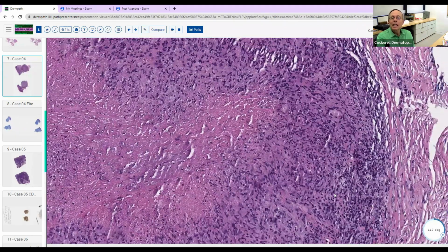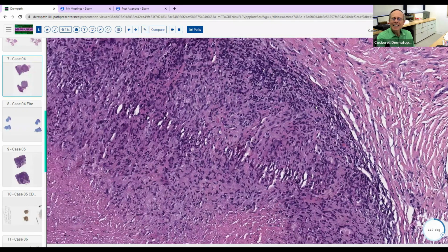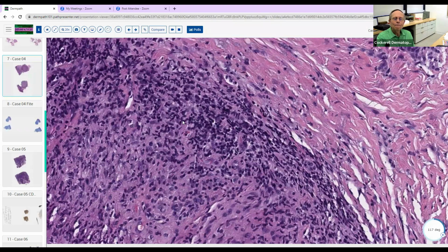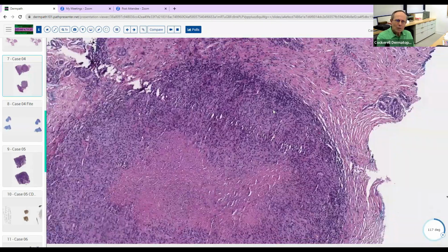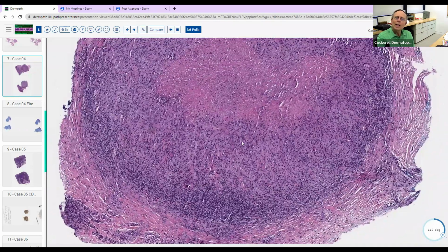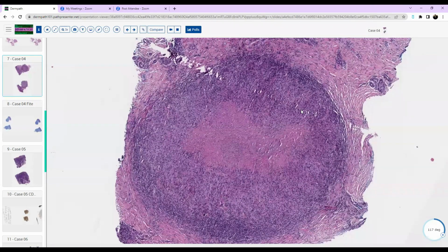Okay, good. Yeah, and there's some fragments of cells in here, but I didn't see all that many neutrophils. It's interesting. Most of these are lymphocytes and histiocytes here. There's kind of a teaching point to that as well. What's your differential diagnosis of this pattern here? So for caseating granulomas, you'd think of infective granulomata. You could think of cutaneous TB, some of the deep fungals.